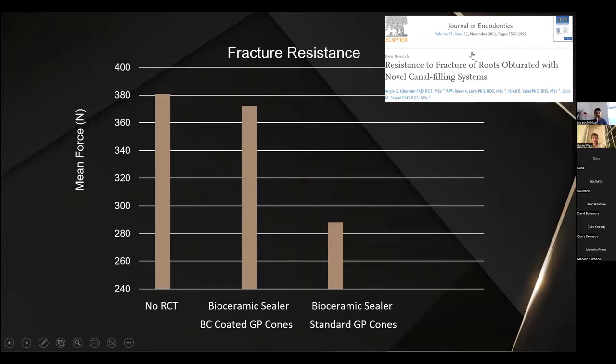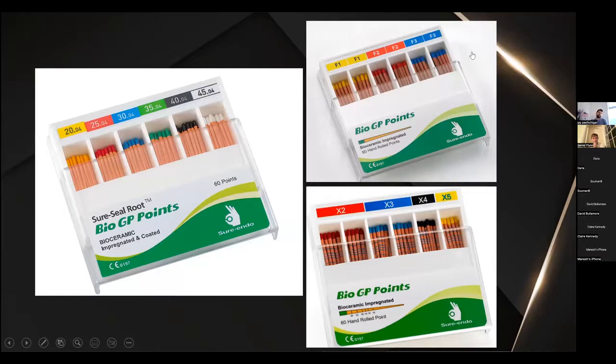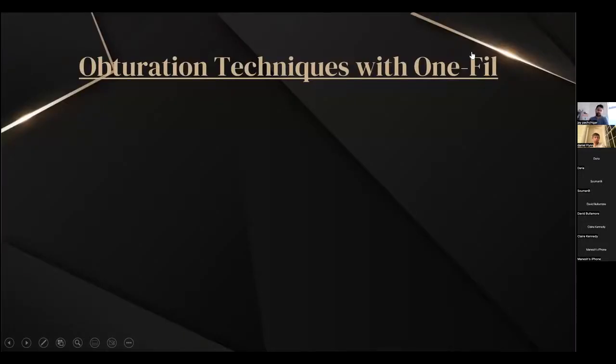Fracture resistance in the mouth has a lot of different factors involved, and how well this translates to teeth in the mouth is always difficult to know, but the results are promising for sure. So these are your bioceramic impregnated and sometimes coated GP cones, and I feel like these help to get that bonding to the GP and to the canal walls as well with your bioceramic sealers. Now, obturation techniques with a bioceramic sealer. If you are looking to switch and start using these, there are a few ways in which you can.